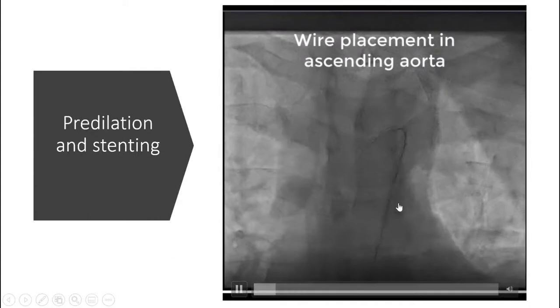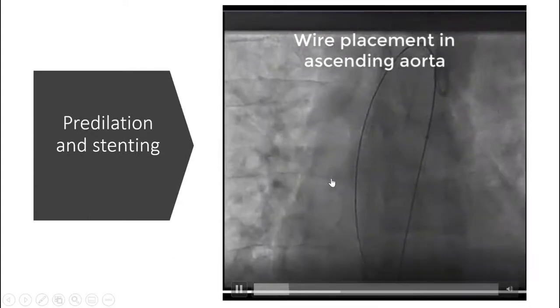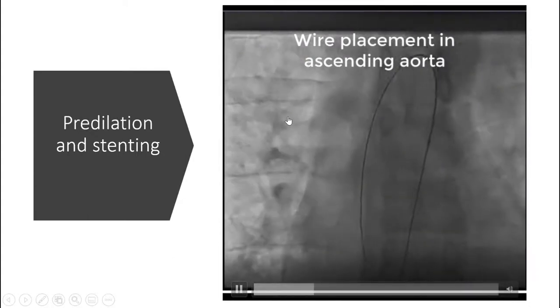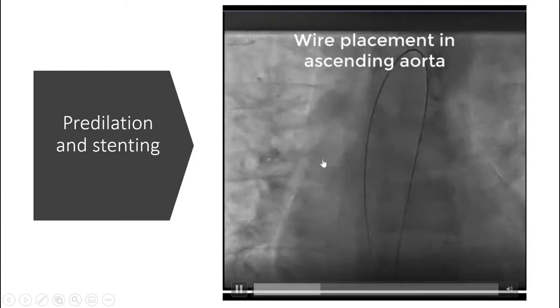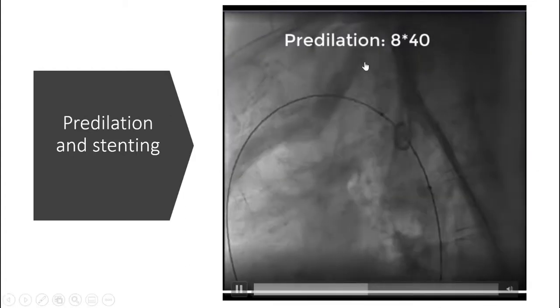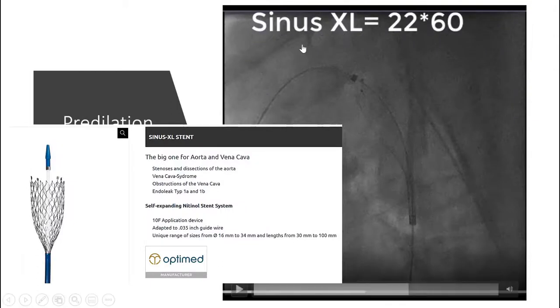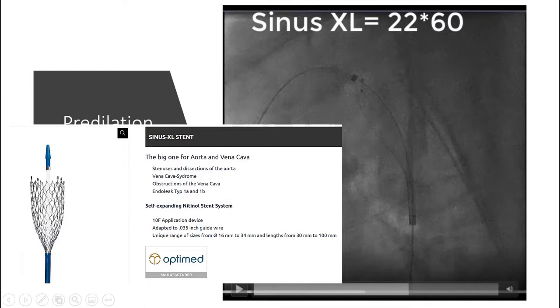After passage of the catheter from the coarctation to the ascending aorta, a stiff supportive guide wire was placed in the ascending aorta. After that, pre-dilation with an 8 mm balloon was performed. We decided to place a Sinus XL stent — a self-expandable bare metal stent — from the left subclavian artery, across the coarctation and over the right anomalous subclavian artery.